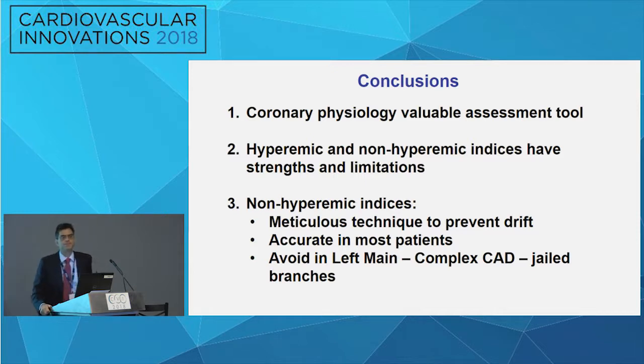Does anemia affect these indices? That's an excellent point. So you're suggesting that because of anemia, your resting myocardial flow is going to increase to some extent. Good question. I don't know. I don't know if you know. I don't think it does, but it's a great question.